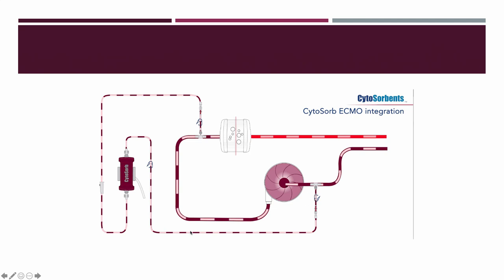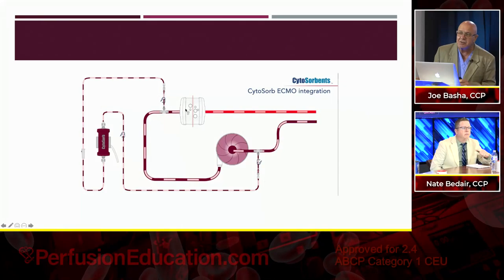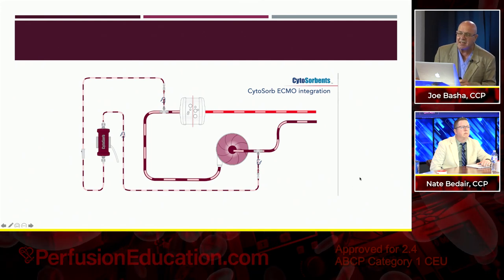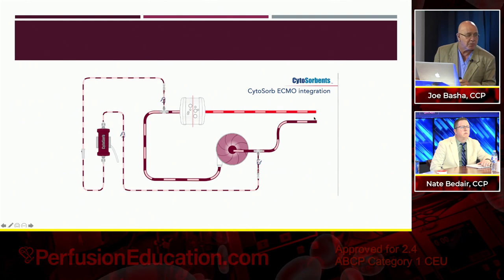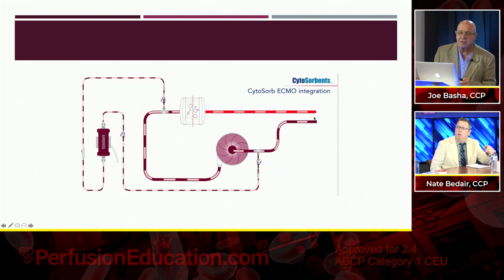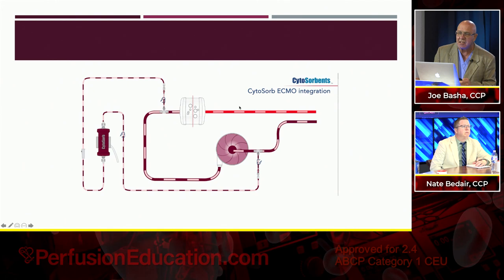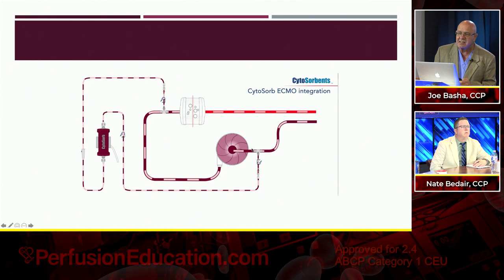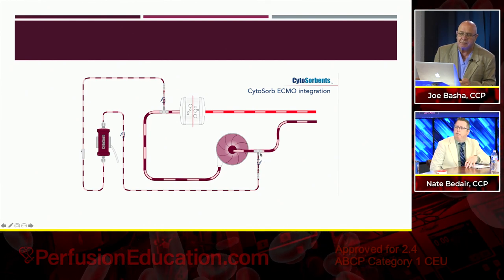The other is you're going to have some recirculation, because you see it coming through, going this way, going into here, and then it's returning. So some of that treated volume will end up coming back out here, to some degree. And then it goes through your oxygenator here back into the patient. So this is how you easily integrate it into an ECMO circuit. And there's no extra pump needed for that. No extra pump, just all off of pressure, right? Because this is going to be positive, about 200 to 250, and this is going to be negative, about 100 to 150.